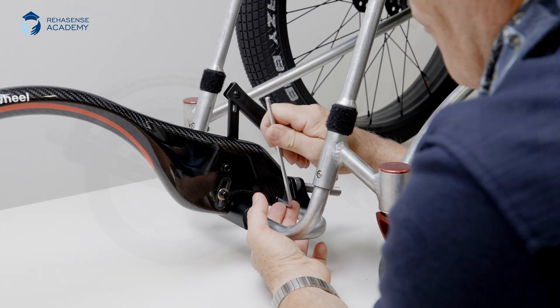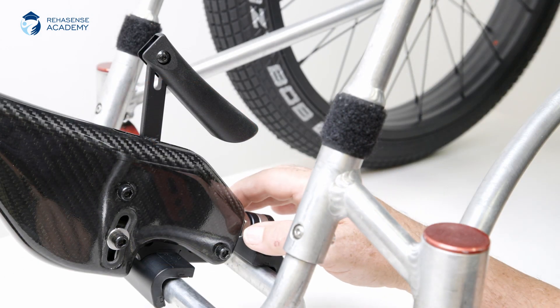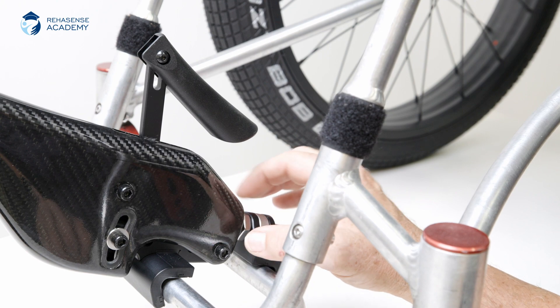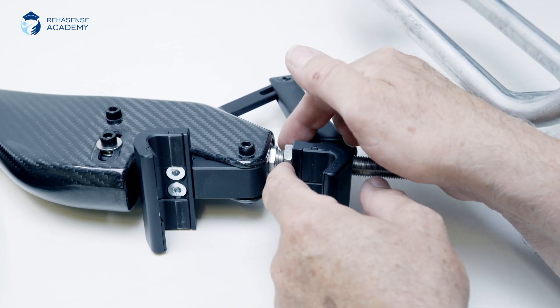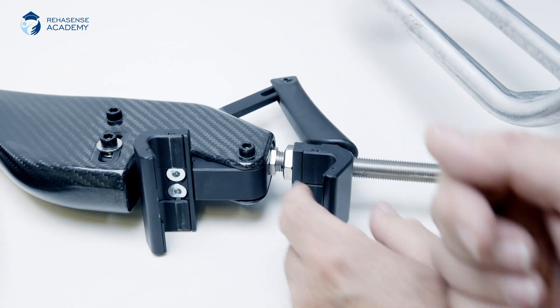When you turn the track wheel into the driving position, you will find that the wheelchair casters are lifted about five to seven centimeters from the ground, and this is the perfect mount. When everything is adjusted, lock the rear clamp by tightening the nut.